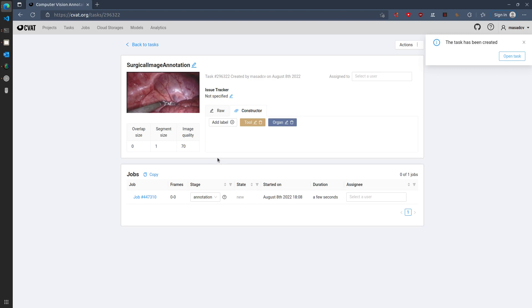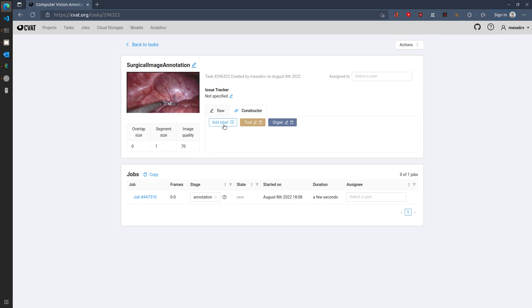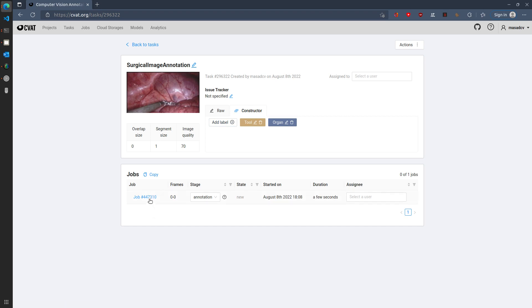And then you can see the different properties. For example, we have this task surgical image annotation task. We have labels here, so you can also add additional labels if you know them. And then you can access the different jobs which are associated with the images or the videos that we uploaded.